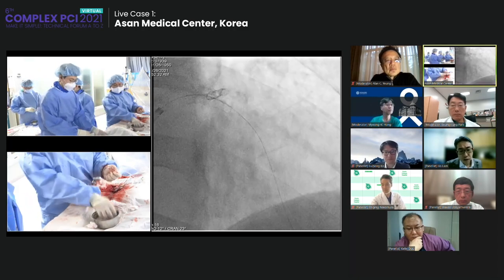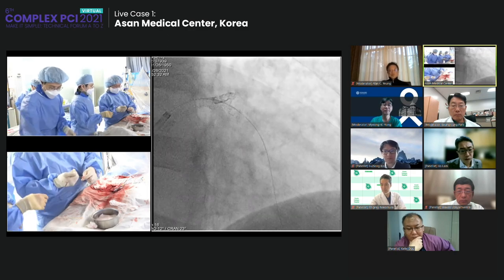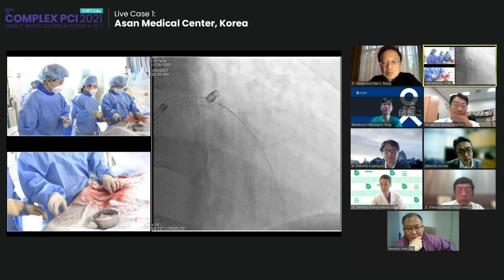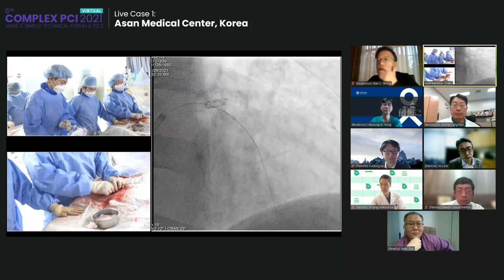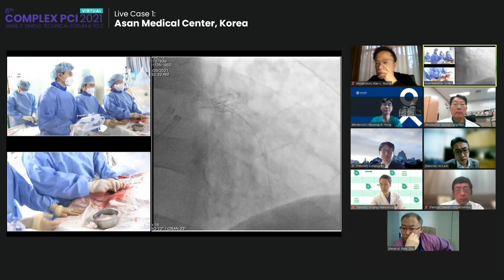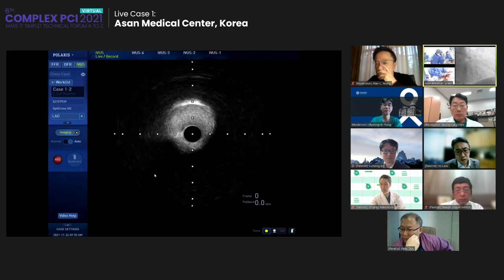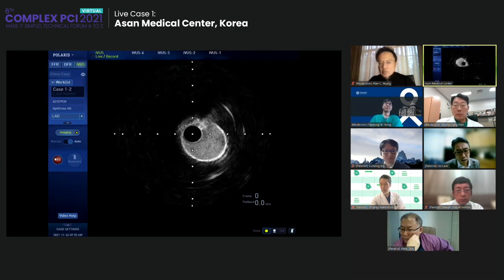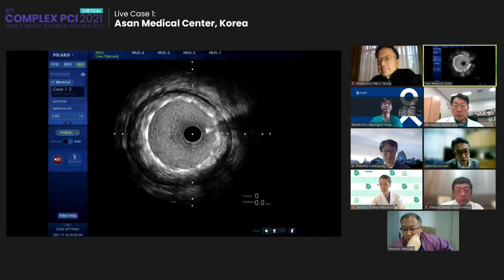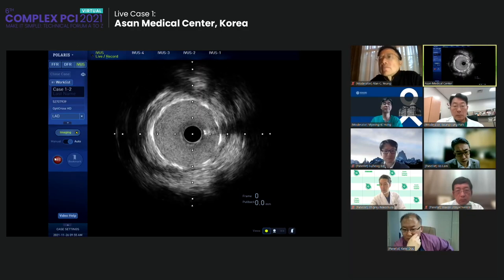Fourteen, sixteen, eighteen, twenty, deflation. All right. 25. IVUS, please. After IVUS evaluation, if there is some malapposed area, I'd like to apply the 4.5 high pressure balloon. Long, please. The proximal stent is well apposed to the vessel wall. Okay.